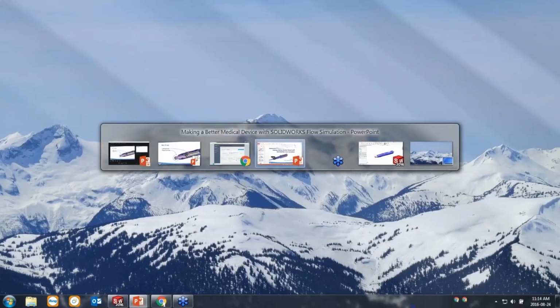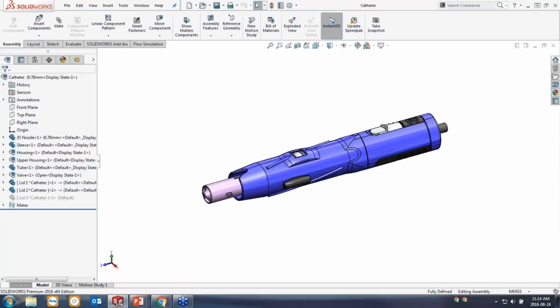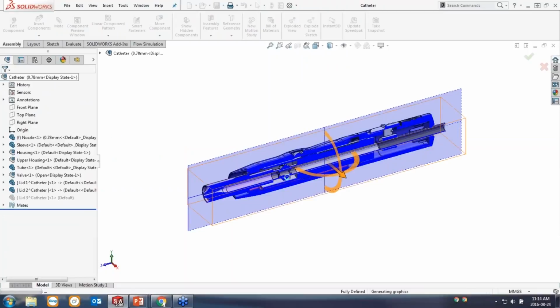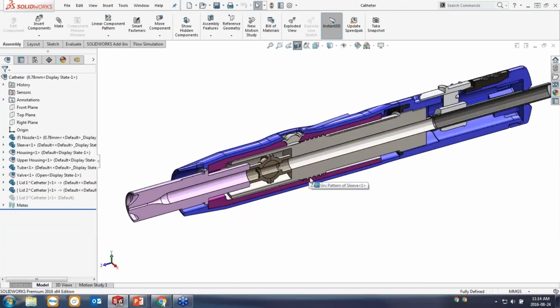So I think that's enough PowerPoint as well. Let's jump right into the software here. You can see this is my device, and if I take a look inside with the section view, you can see same as the image that I showed you there.